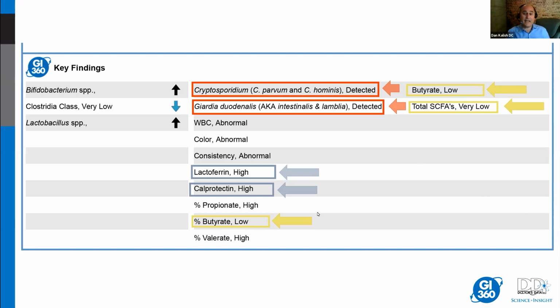Okay. And then for stage 2s, lactoferrin high, calprotectin high, you're seeing a problem with the organ. So you're always thinking, the microbiome, is that good or not? The organs, are they good or not? And if not, which organs? And then pathogens, are there bugs? If they're bugs, is it bacteria, yeast, parasites? What am I going to need to kill? Those are the main decisions, okay?